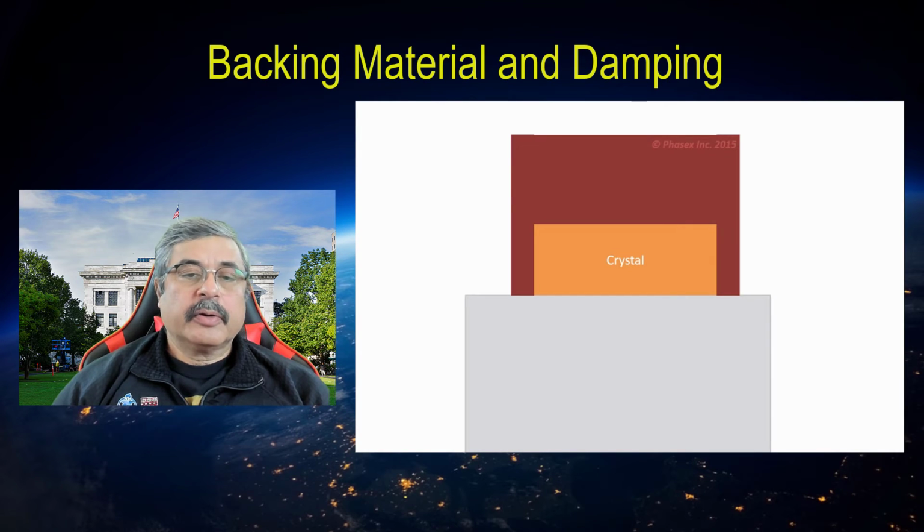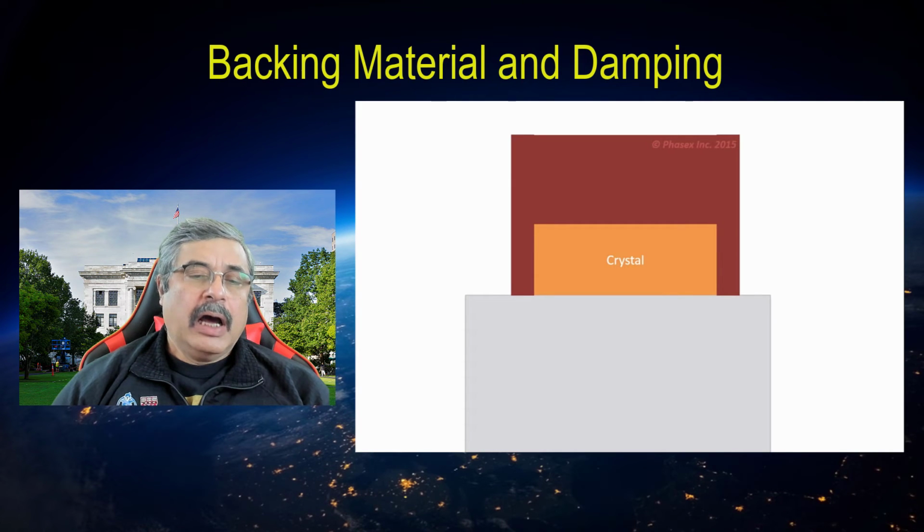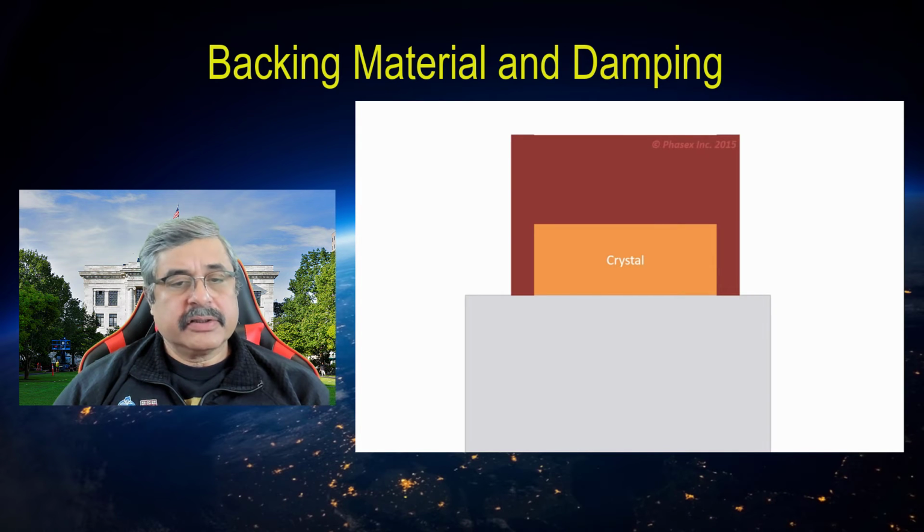So now let's try to apply these analogies to the transducer design and see how the application of backing material in the transducer results in damping of the continuous vibration of the crystals, leading to multiple short clicks with shorter pulse duration and therefore a better axial resolution.